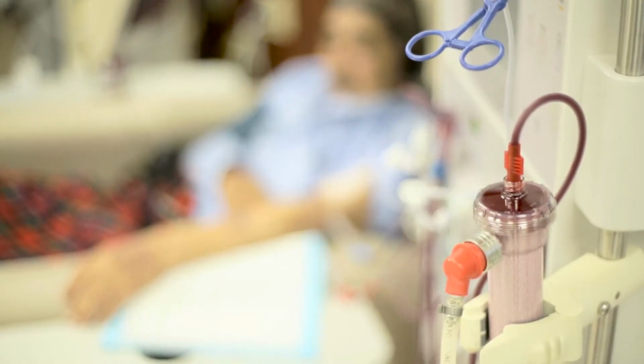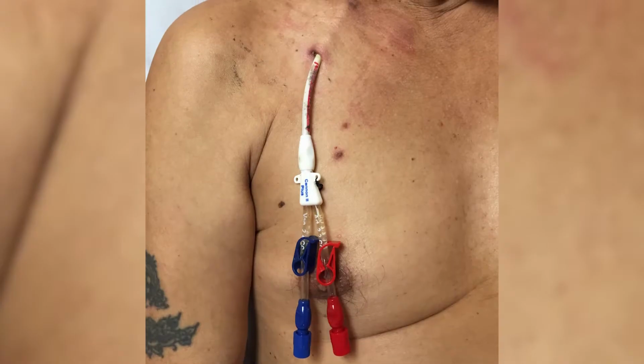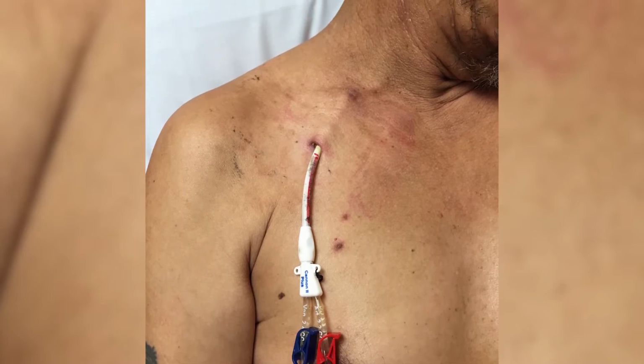If hemodialysis has to be started and the patient doesn't have a graft or a fistula in the arm, then they will need a tunneled dialysis catheter. This catheter will go into one of the large veins in the neck, called the internal jugular vein, either on the right or the left. The tip of the catheter actually sits right above your heart.